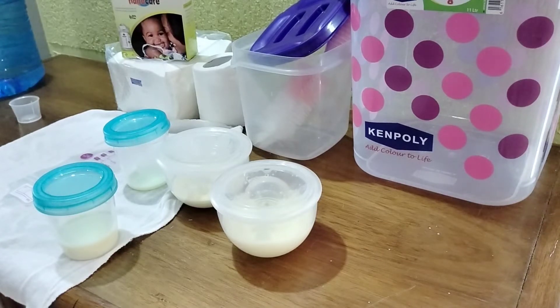Today in this video I want to show you how much I expressed in a pumping session from both sides, and I also want to show you how I package the breast milk for the baby. I hope you learn something. You can also tell me how you do it for your baby, especially for those who are returning to work.